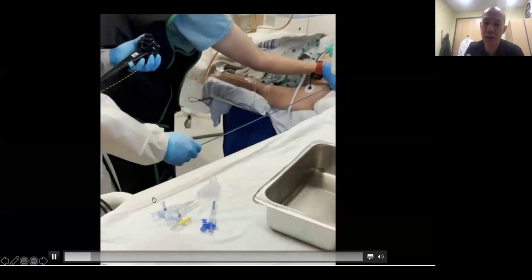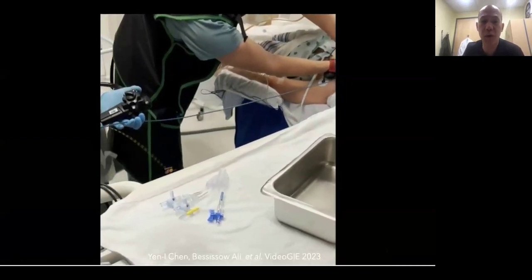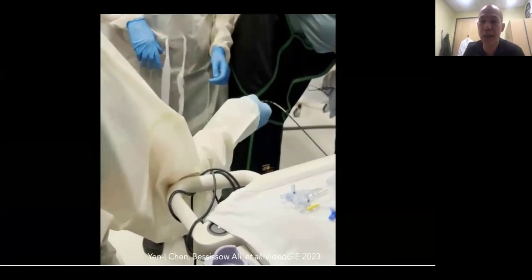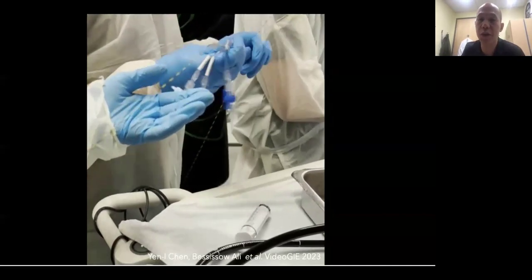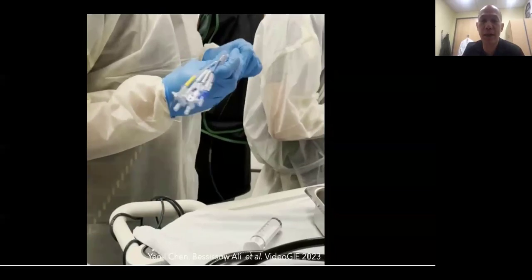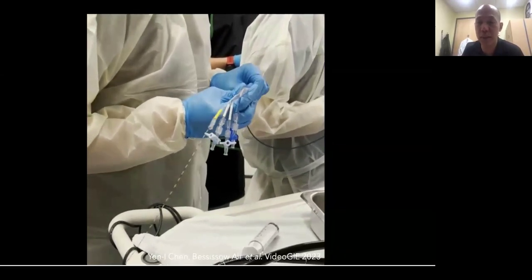We then removed the endoscope by keeping the catheter in place. And I'll explain to you why the proximal end is so important to be removed. You can see here that we can simply remove the endoscope because the proximal end has no hub. So you just slide it off. This allows us to send the catheter to a location and then put the proximal end back onto the catheter to allow independent infusions of different compartments.